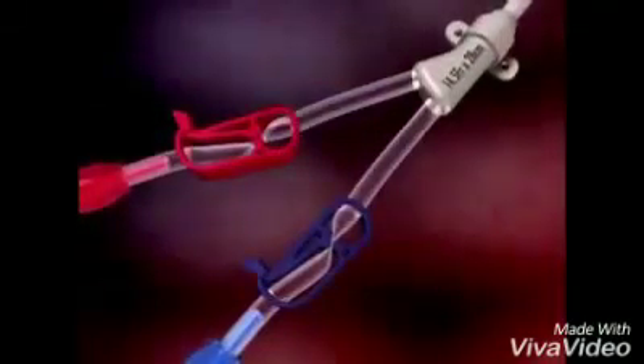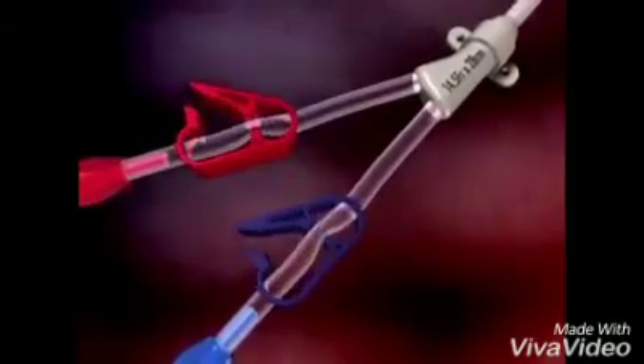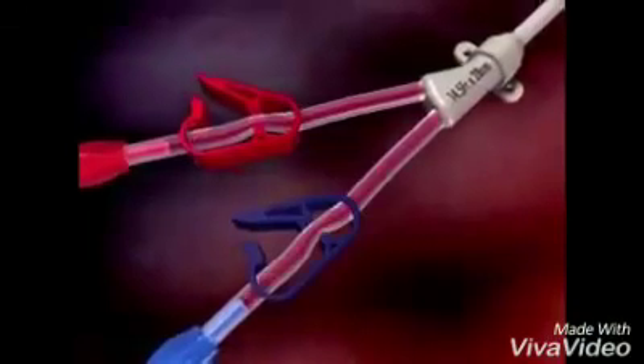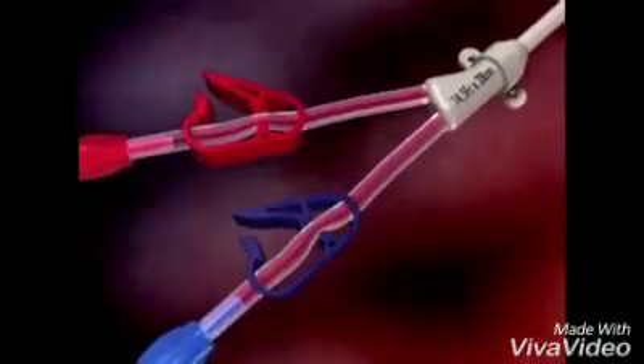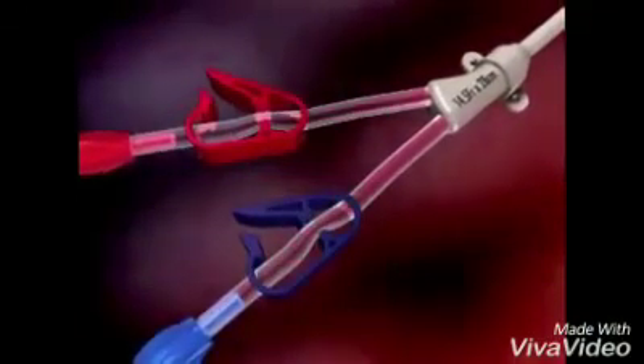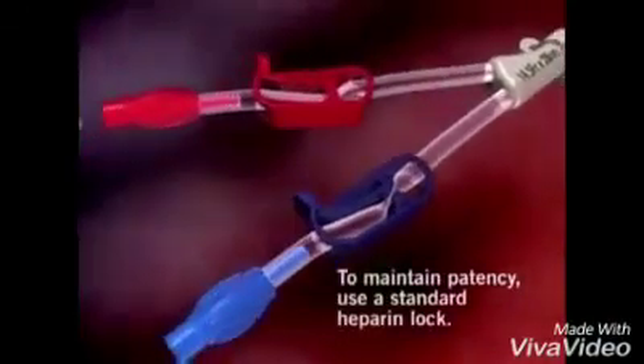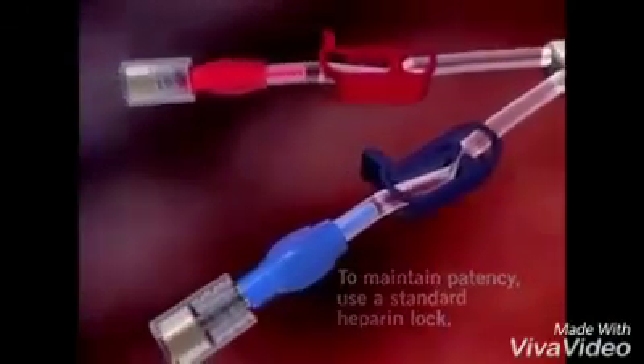Attach syringes to both extensions and open the clamps. Blood should aspirate easily from both arterial and venous sides. Both lumens should then be flushed with saline-filled syringes. Close the extension clamps, remove the syringes, and place an injection cap on each luer lock connector.